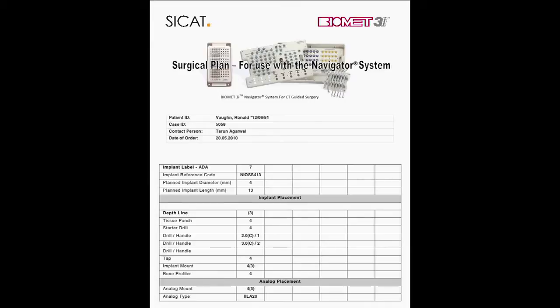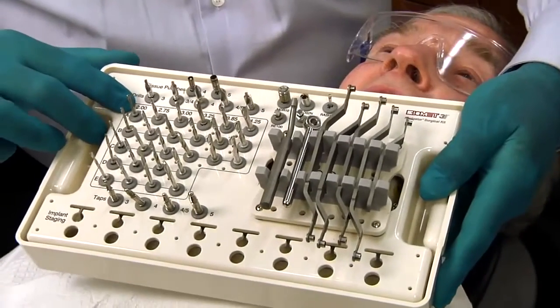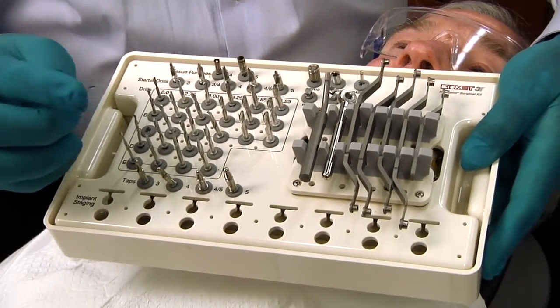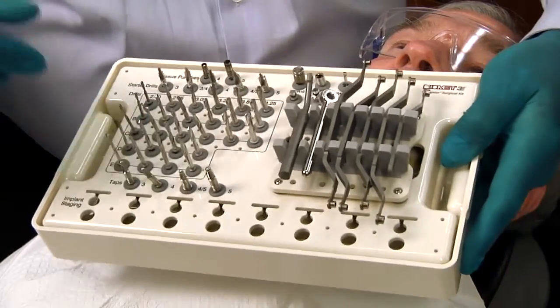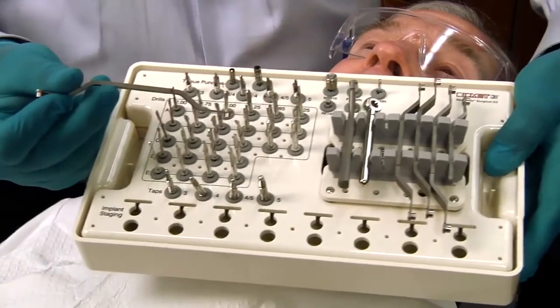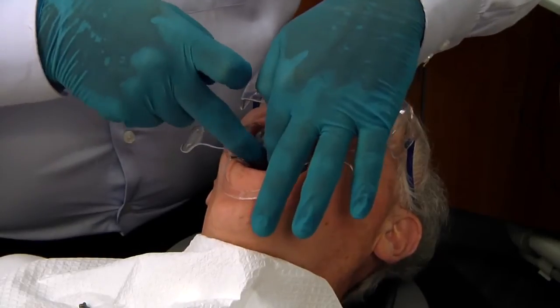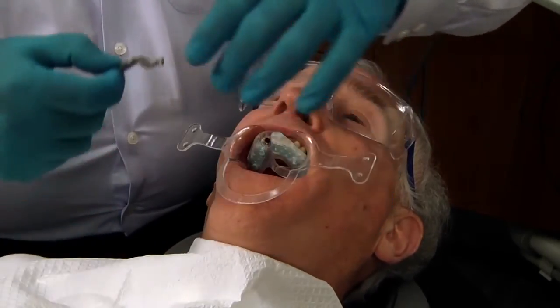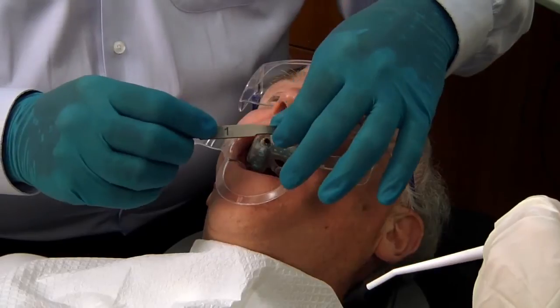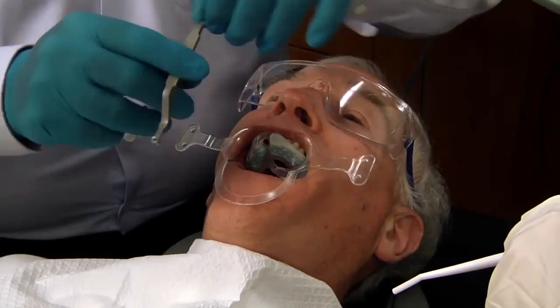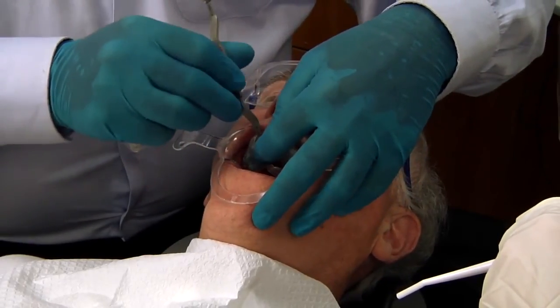For example, if you drop down to drill handle and it's in order, so the first one says 2.0 C slash 1. 2.0 C, so I'm going to go to the 2 and then the C. This is the 2 C and the number 1 refers to handle number 1. So we'll place our drill guide in, and then again remember the system called for sleeve number 1 on the 2.0 millimeter side. So we'll place that in.